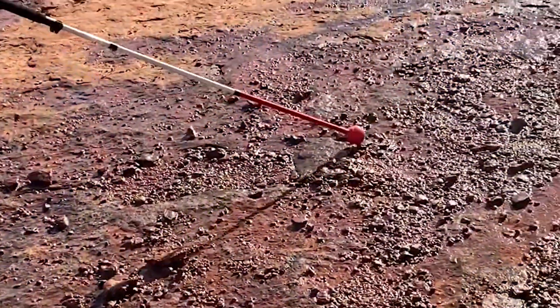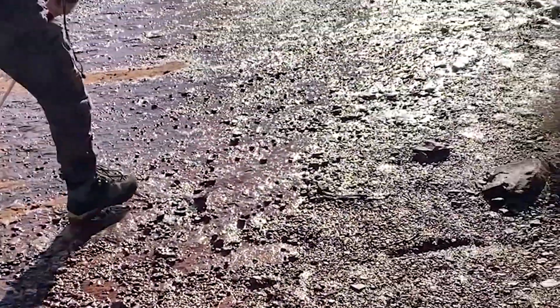CSUN 2023 — we're stopping at a booth I've not been to before. This is Awarewolf Gear, and we're looking at a new product, the ATC, or All-Terrain Cane. Dave and Barry, thanks for joining us. The all-terrain cane is a super strong but super lightweight mobility cane designed for hiking and everything else you want to do outside.